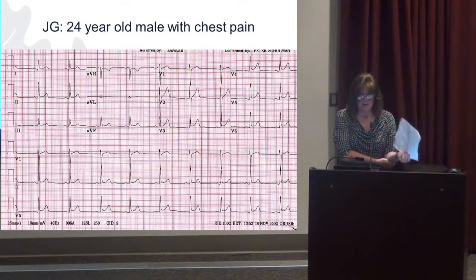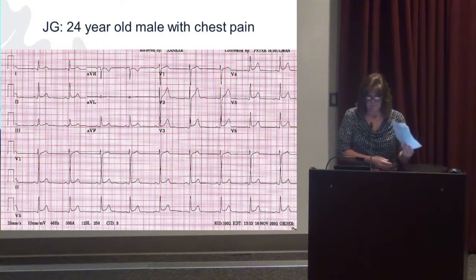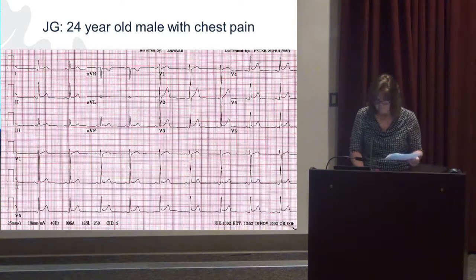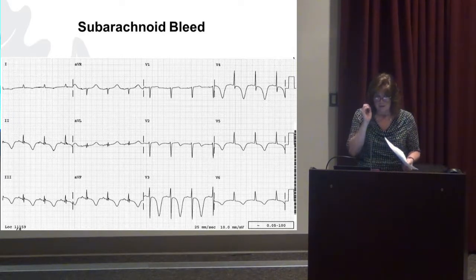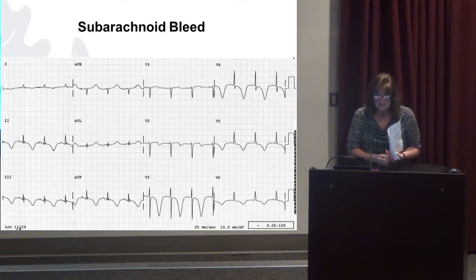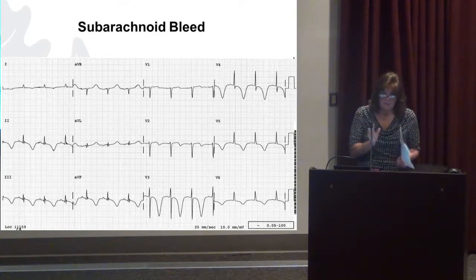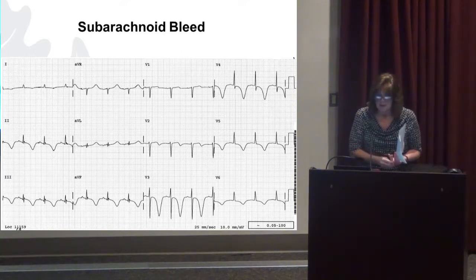Okay, he's 24 and he's African American. Call this J-point elevation. You need to correlate this clinically with the symptoms and what else is going on. Does he get rushed to the lab? No. Okay. These aren't straightforward. Now this, yes. Right? So yeah, you have to correlate that clinically. What's that chest pain like? Is it cardiac pain? Say he didn't have any chest pain, we say this is totally just J-point elevation, but he has chest pain with it. Definitely requires some further investigation.